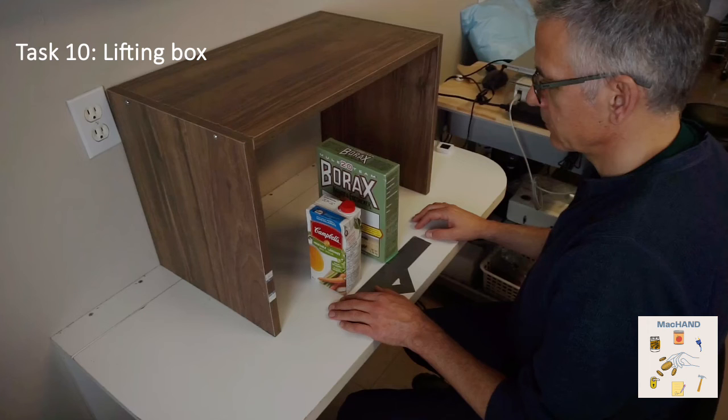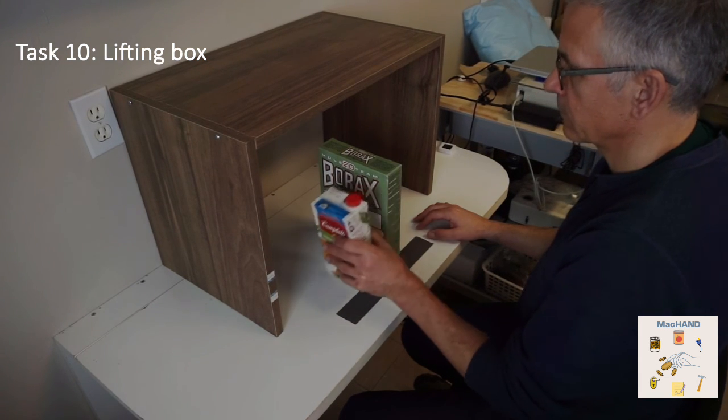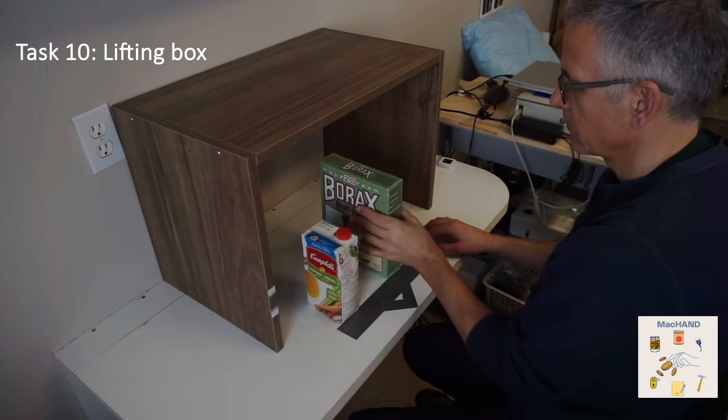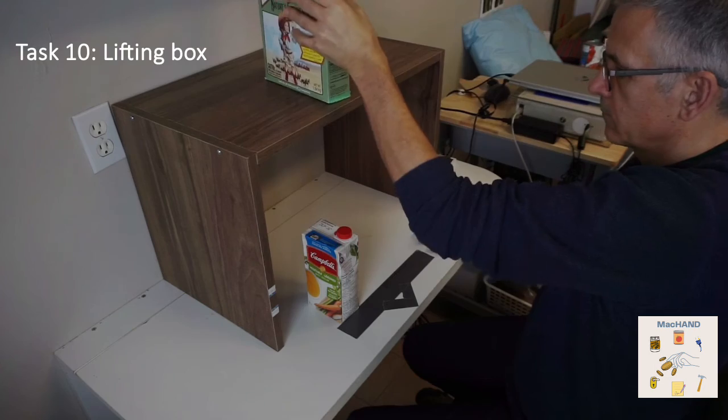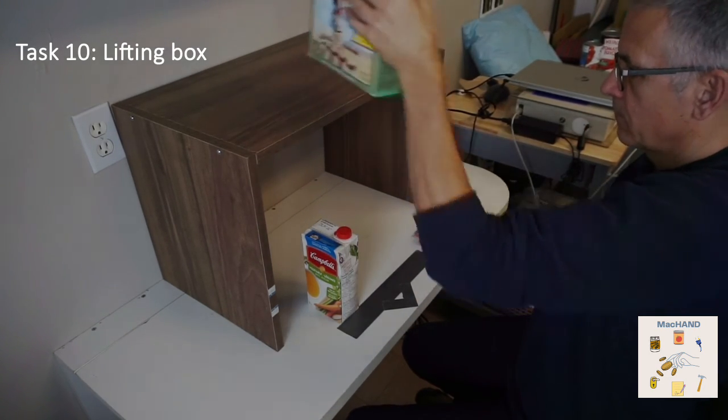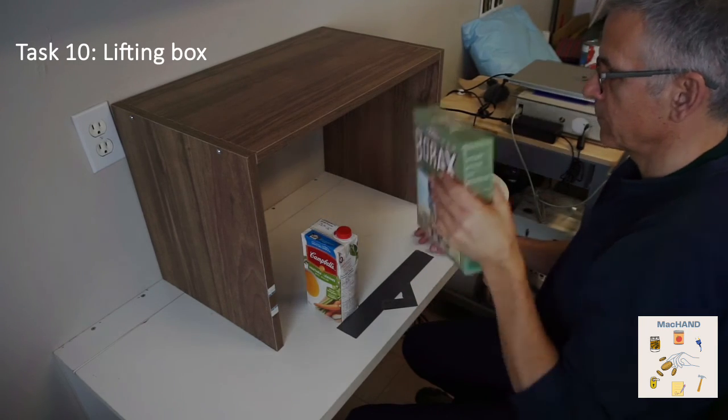For this last task, the patient is asked to lift the small box on the table on the top of the shelf and put it back on the table. They are then asked to do the same thing 3 times with a bigger box. The assessor's focus is on lumbrical grasp with functional reach, shoulder flexion, extension, and endurance. If the patient uses the other hand to support the object, this automatically gives a score of 1.